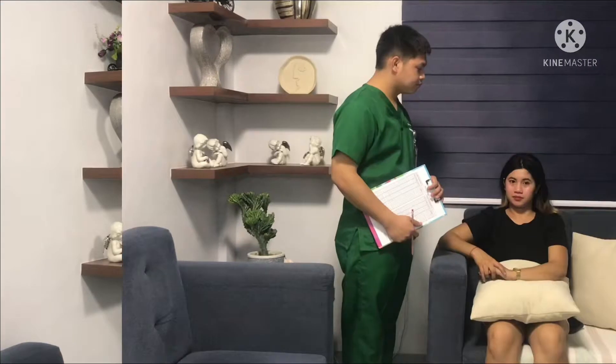Good day! I am John Bergilio Cicabildo, your student nurse for today from Our Lady of Fatima University, Quezon City. And today, I'm going to demonstrate blood glucose monitoring.